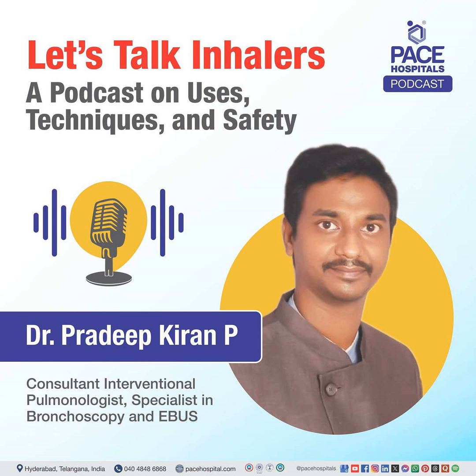Dr. Pradeep Kiran, a lot of people use inhalers for asthma or other breathing issues. What kind of side effects might people experience when they use inhalers? The most common side effect with metered dose inhalers, due to improper technique or in the last doses of the inhaler, when there is more propellant gas compared to the medicine, is that the patient may have an increased amount of cough.